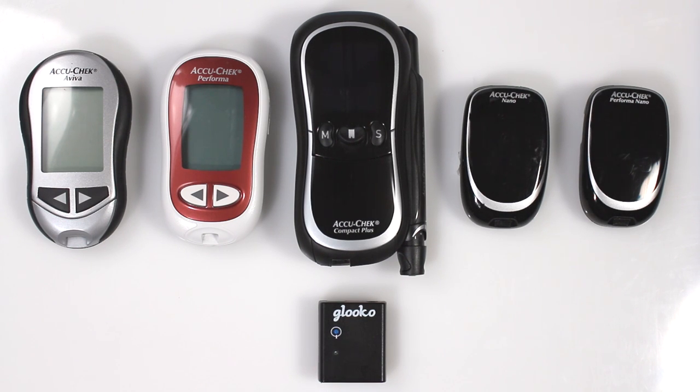By now, you should have already paired your Gluco Meter Sync Blue with your mobile device. If you have not yet paired, please pair your Meter Sync Blue from the settings screen on the Gluco app.